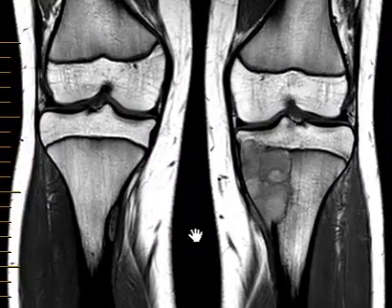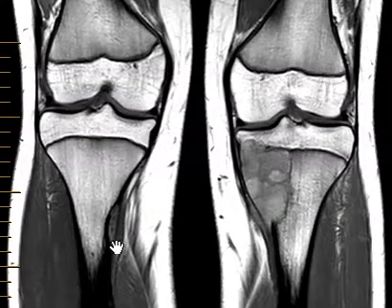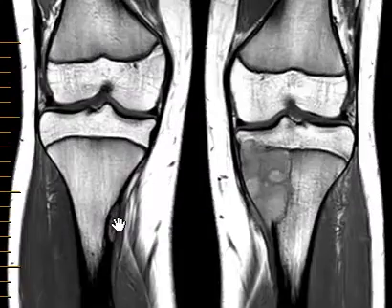On this MRI we see both lesions. This is the right side. We see this well-defined eccentric bone lesion with sharply defined margins, non-expansile. This is a classic look for just a benign non-ossifying fibroma — a really common, don't-touch-me lesion.